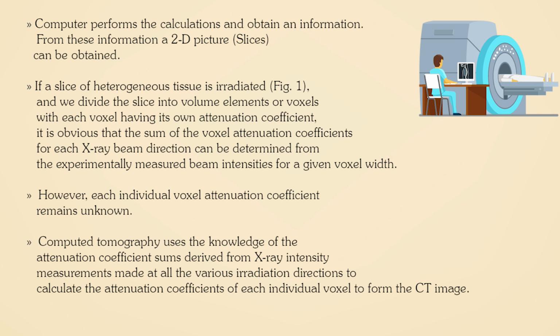The computer performs the calculations and obtains the information. From this information, a 2D picture, that is, slices, can be obtained.